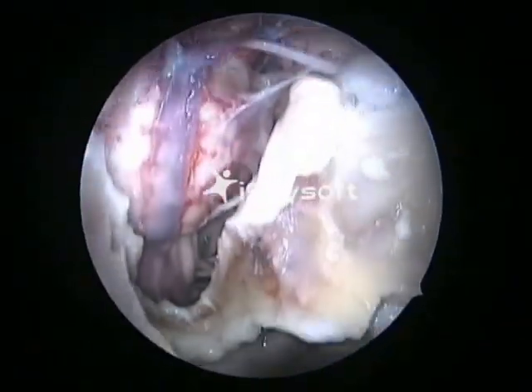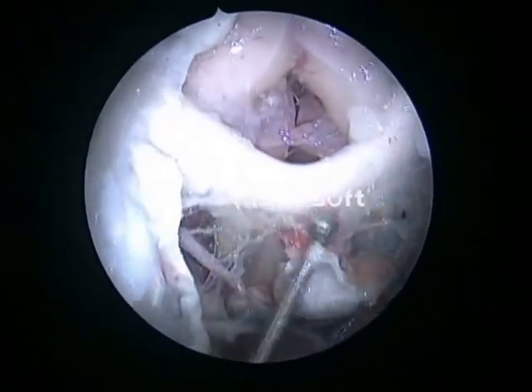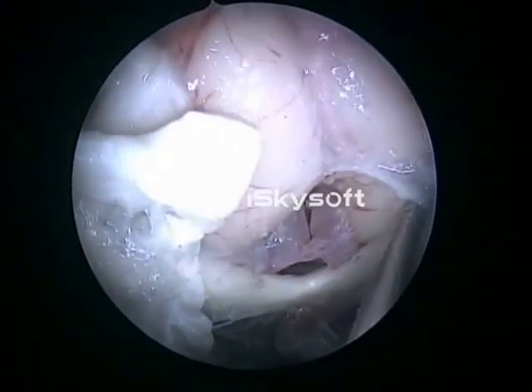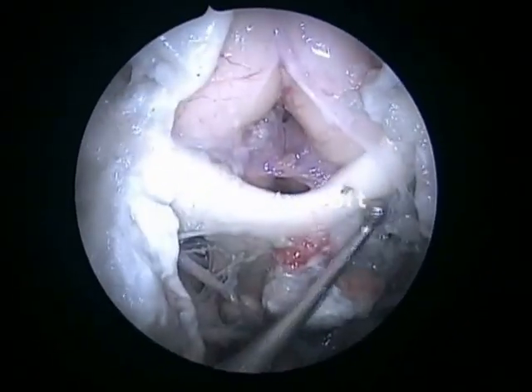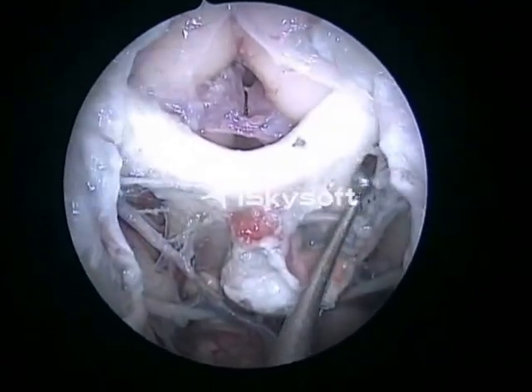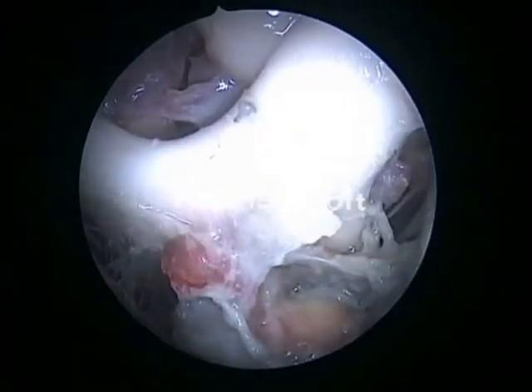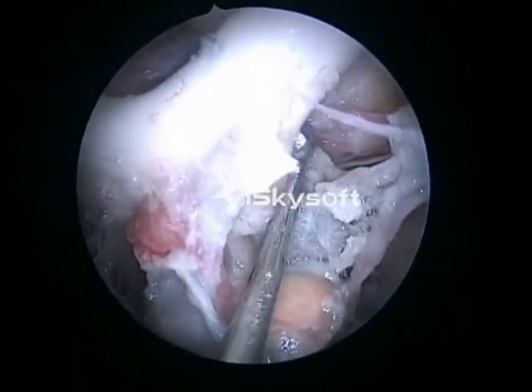and now that's the optic chiasm, the final look, and that's the second nerve and the first nerve. So all the cranial nerves can be seen by this approach, and just a final look at the anterior cerebral artery, the A1, given off from the internal carotid artery. Thank you very much.